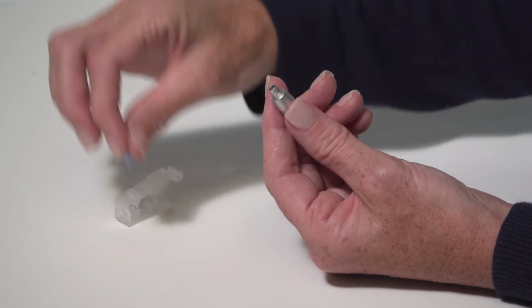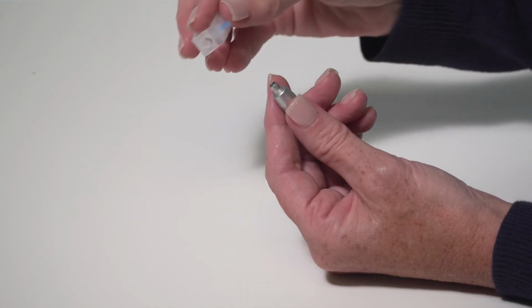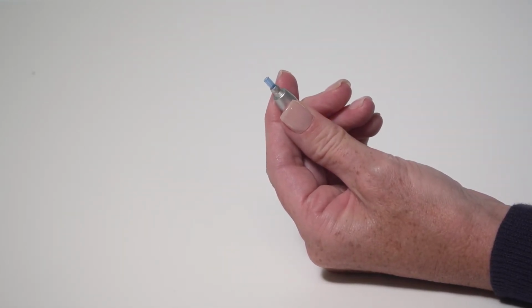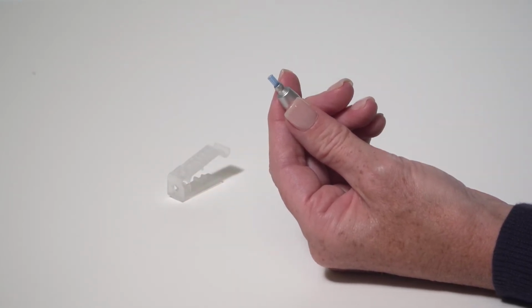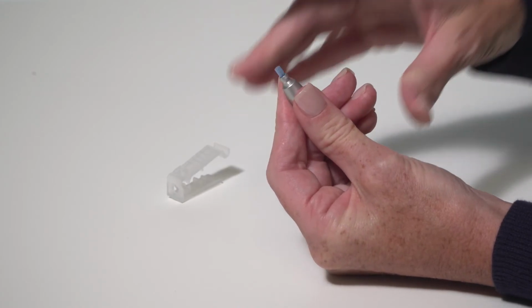Place a new tube into the side hole of the tool. Align the probe with the tube. Push the probe onto the probe tube until the probe contacts the face of the removal tool. Remove the probe from the tool and confirm the probe tube is completely seated by pressing it with your finger.